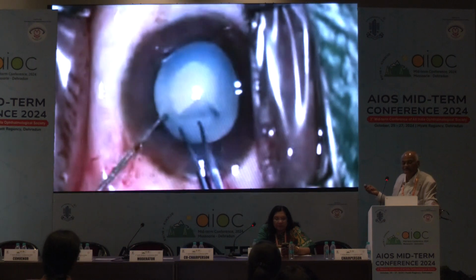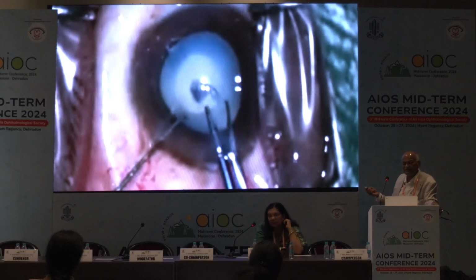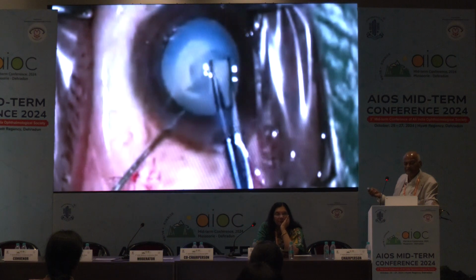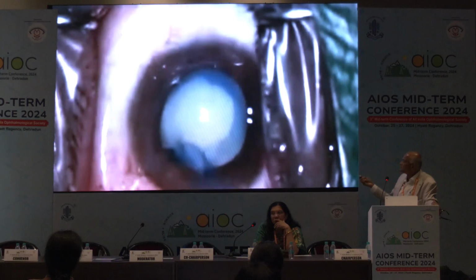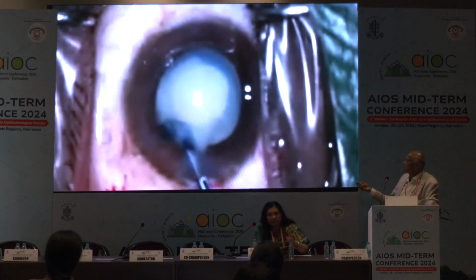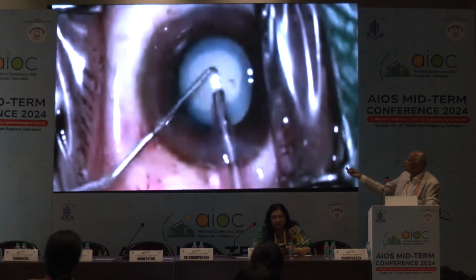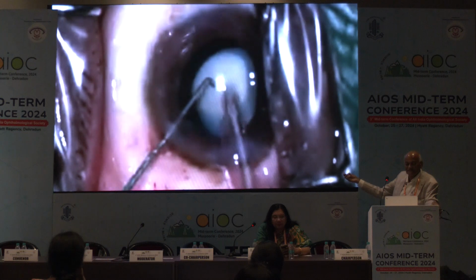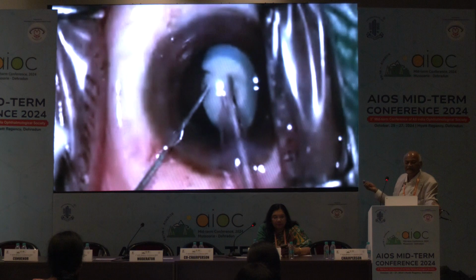Now see, I am using the forceps, and always remember, in such a situation, it is always better to use the forceps, and the forceps will help you in doing the rhexis. So I have completed the rhexis. Once I have completed the rhexis, I am removing the capsule, and this nucleus is a soft nucleus. It is not a hard nucleus. See, can you see the nucleus is moving here and there.